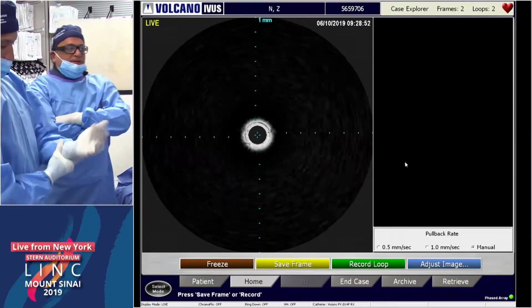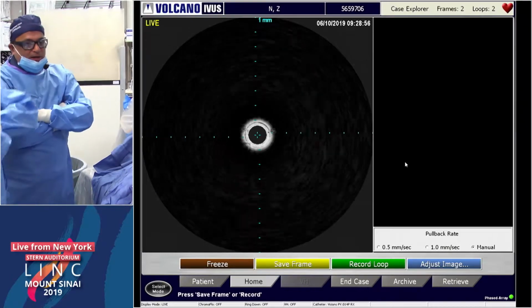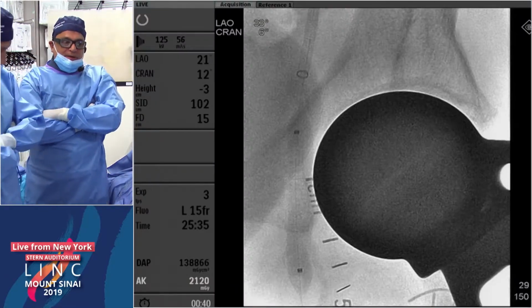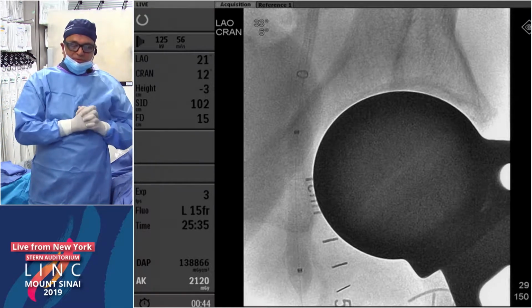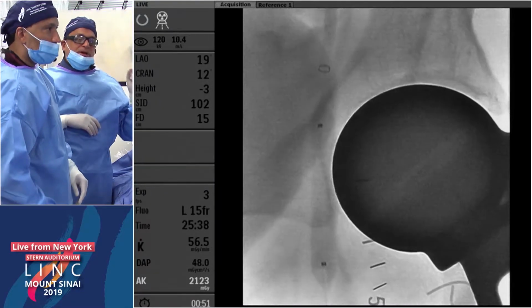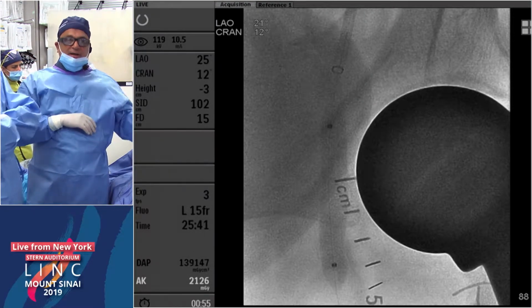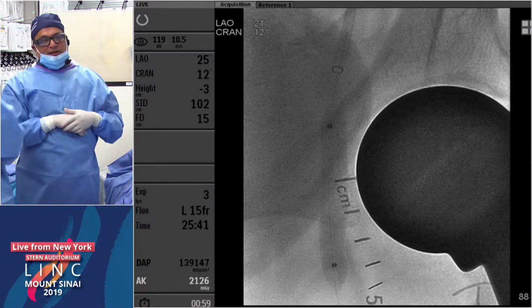So the reason we picked this case, Dirk, is that this is the kind of case that I believe at this stage, at least in the U.S., we can tackle endovascularly. Obviously the bifurcation, I defer to Brian as well to talk about from a surgical perspective. But in this kind of case, without a bifurcation lesion, if you can get away with saving this lady from having a surgical incision and provide her some durable results at her advanced age, I think we're doing this young lady a service.